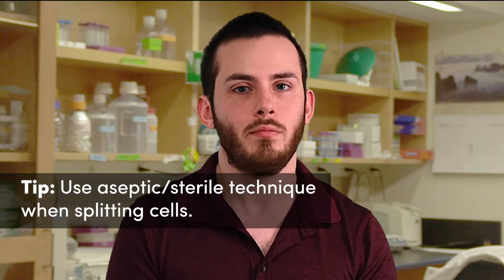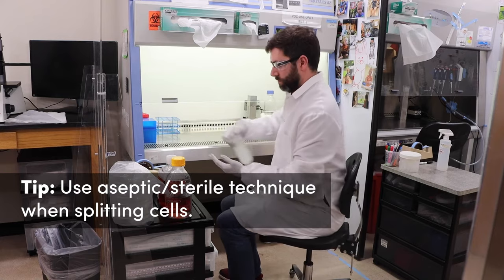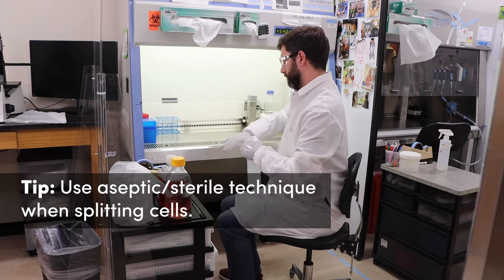Splitting cells is also known as subculturing or passaging. Regularly splitting cells will help to keep your cells healthy, and in turn can give your experiments the best chance of succeeding. Our first essential tip is a basic reminder to always use sterile technique to avoid contamination when splitting or feeding your cells.